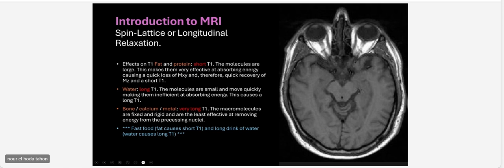You can say, for example, okay, I see here this is also dark. Is this a fluid or is this water? I would say no. If you notice the difference between here and there, this is darker. This is air. So air is always dark like this. And again, this is the paranasal sinuses. You can see always air, since there is no mucosal thickening or something like this.